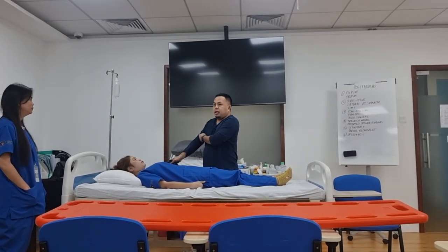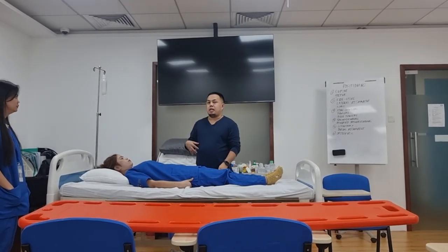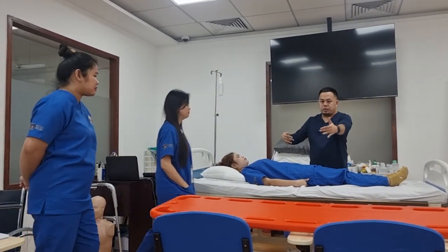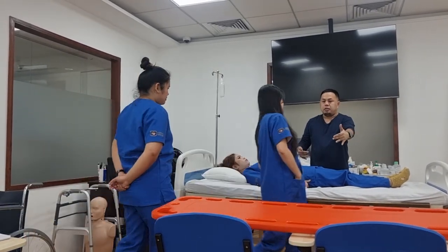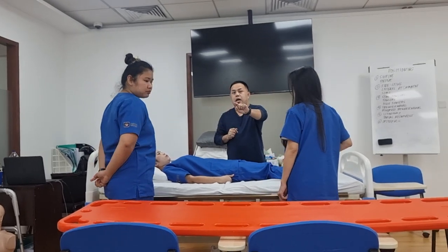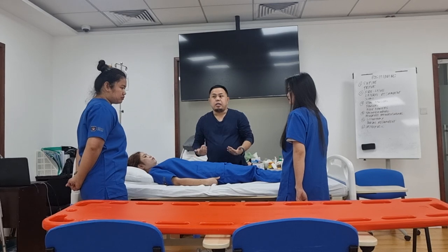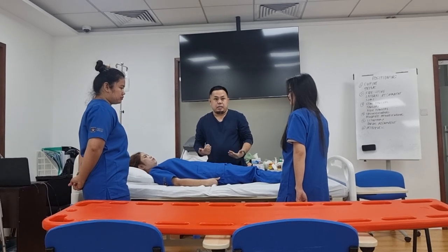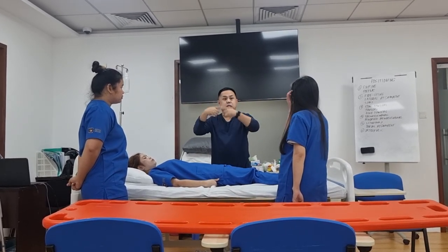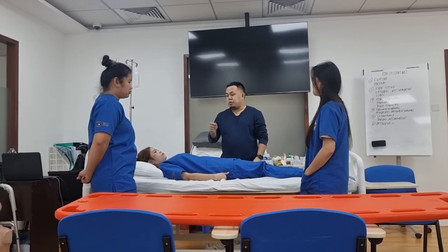I have to introduce myself, identify the patient, and for courtesy and for building trust. Your colleague will stand on the opposite side of the bed. The stretcher bed is on the side — it's not yet placed next to the patient's bed.